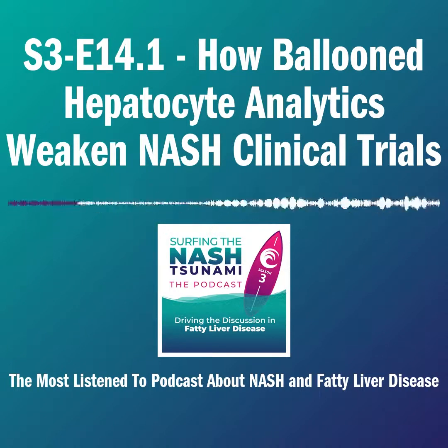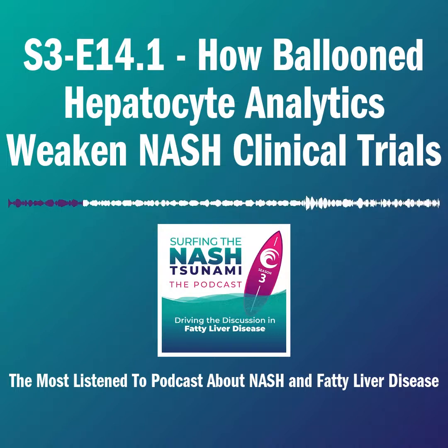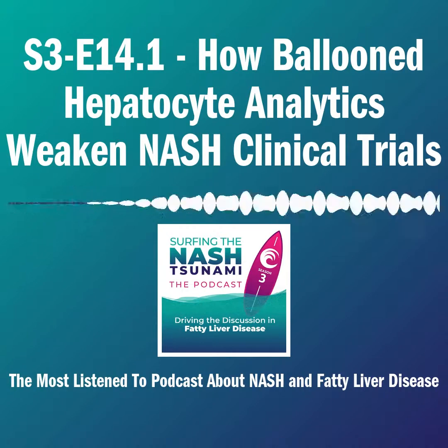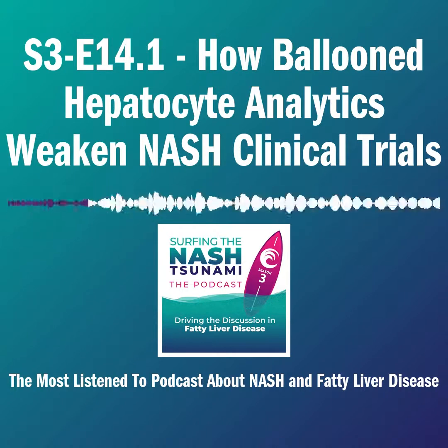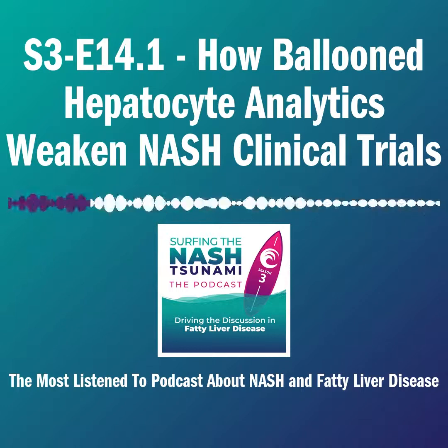The big challenge here is that there have been now a number of studies published over the years demonstrating Kappa values, for example, quantifying ballooning in the order of about 0.56, 0.57, coming out from the NASH CRN. So really excellent pathologists, but even over a 15-year gap, not being able to improve those Kappa values. And then, of course, you saw the data coming out from the Davison paper. Again, the challenges of inter and intra-observer variation.